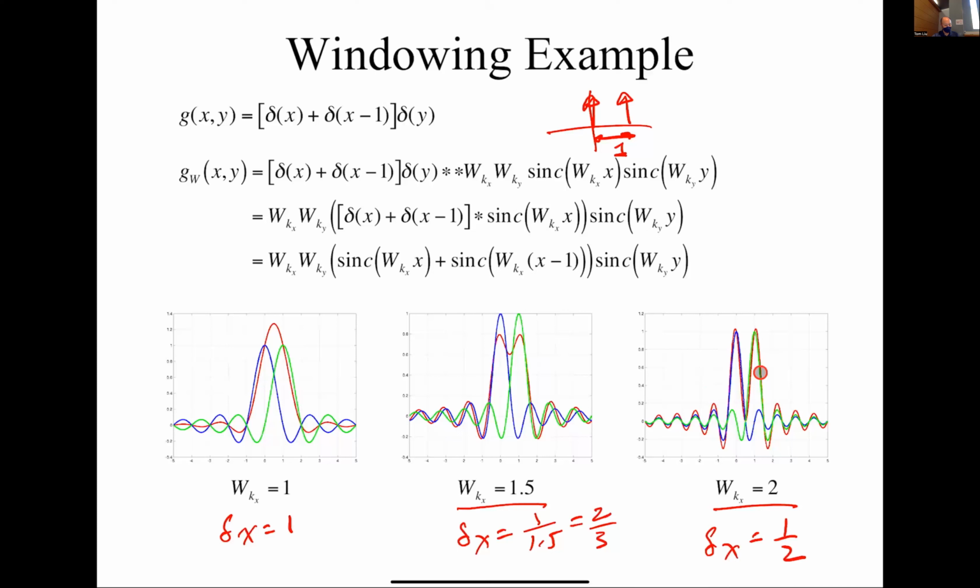Okay, so design equations, we're really at this limit. We're just saying this is the minimum you need. Once you go WKX beyond that, then you start getting into this regime where you can start differentiating things. All right. So for the class, you can always be at this limit where the resolution is at this limit. Okay. Any other questions? Yes.